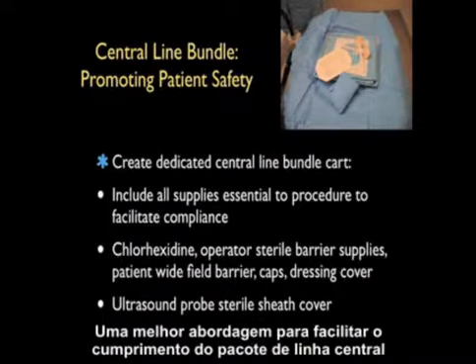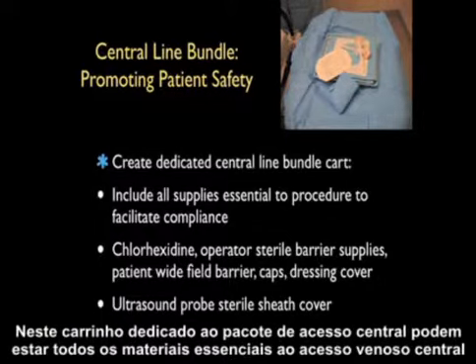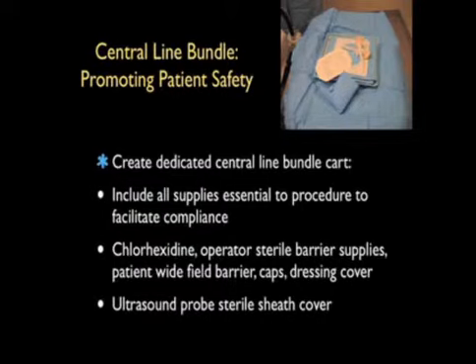An optimal approach to facilitate compliance with the central line bundle is to create a dedicated central line bundle cart that moves to the patient during the actual procedure. On this dedicated central line bundle cart can be included all the supplies essential to central venous access to facilitate easy compliance with the steps.